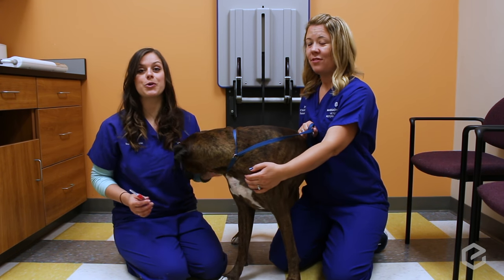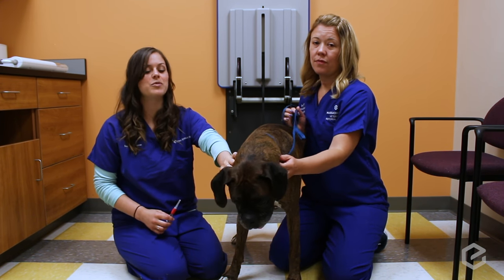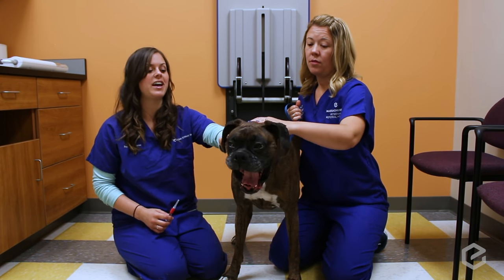Hi, I'm Kim. I'm going to show you how to give your pet a subcutaneous injection of a medication that may have been prescribed by your vet.